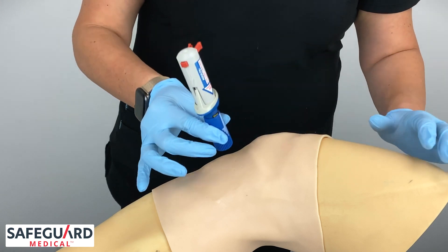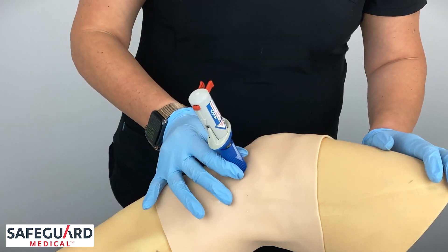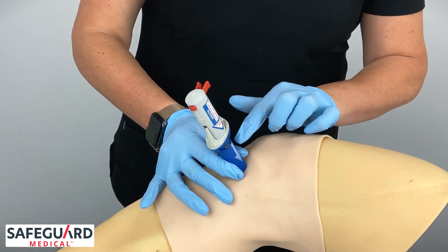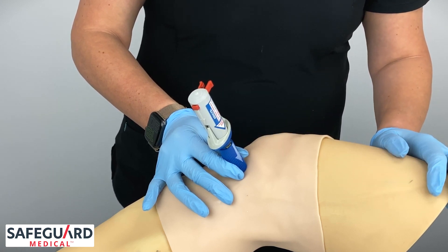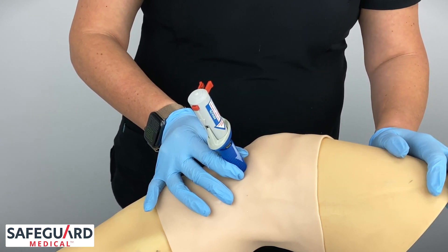Place the BIG firmly against the skin at a 90-degree angle. Note the blue barrel with the white arrow pointing down. Maintain stabilization throughout the entire procedure.